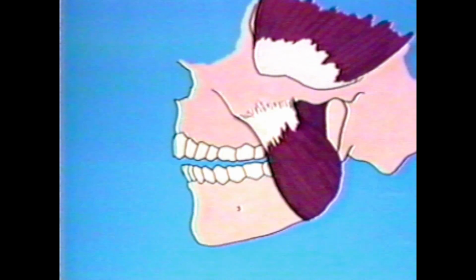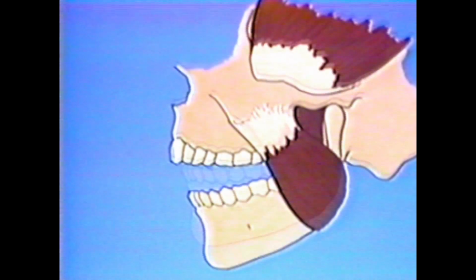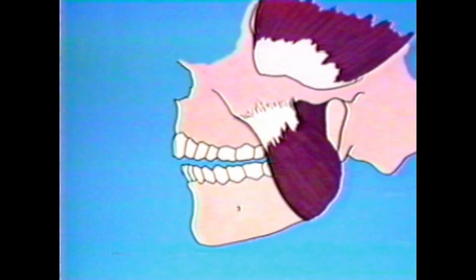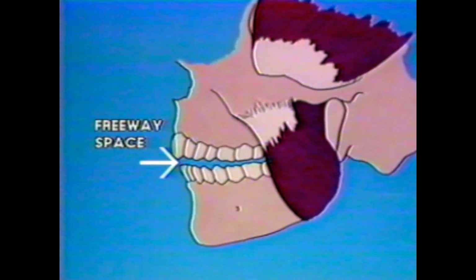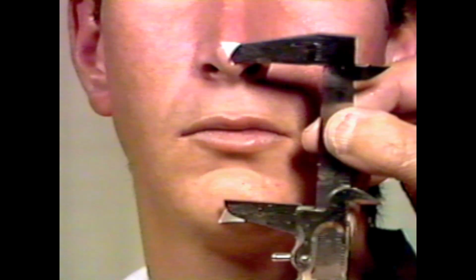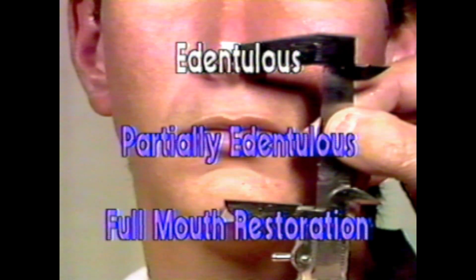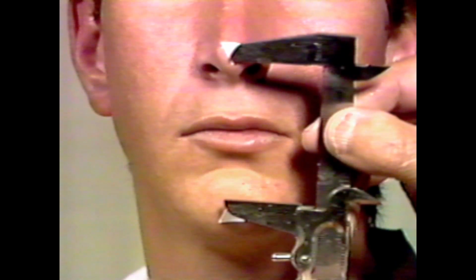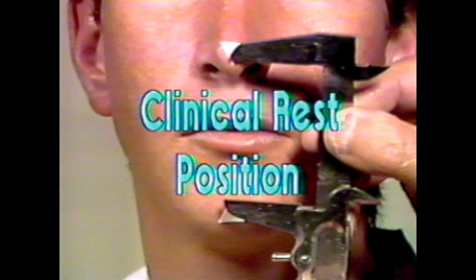This program will demonstrate the difference in masticatory muscle activity between the clinical and the electromyographic rest position. Determination of the clinical rest position is necessary in order to measure interocclusal or freeway space. This space is the vertical distance between the maxillary and mandibular teeth.